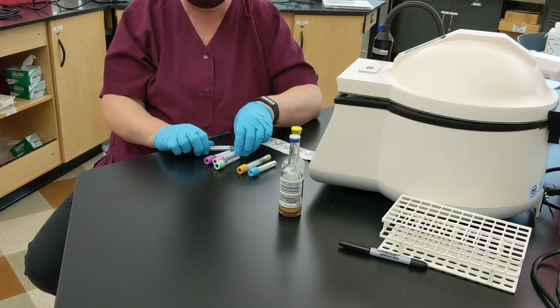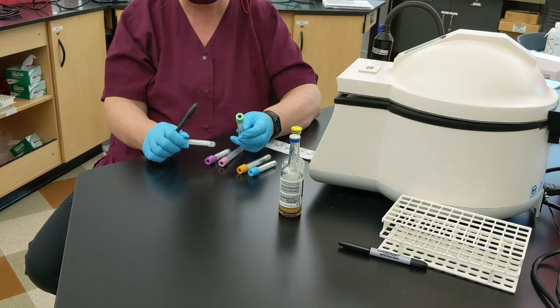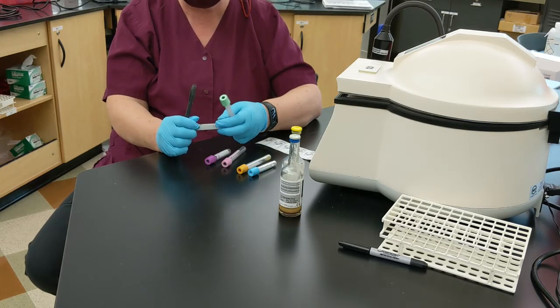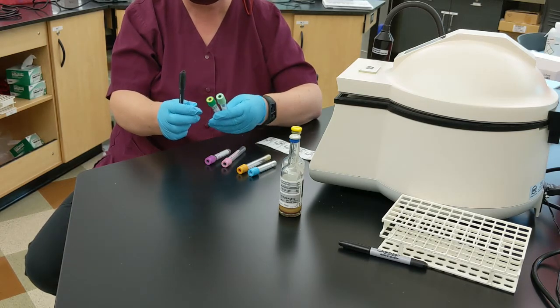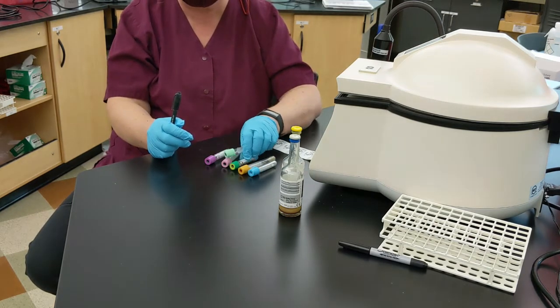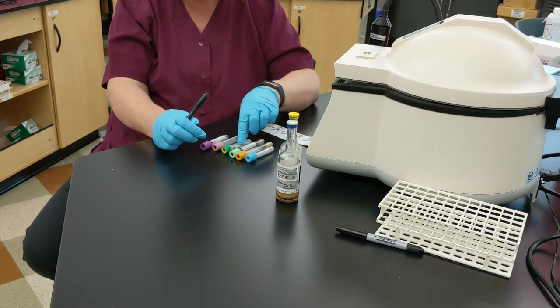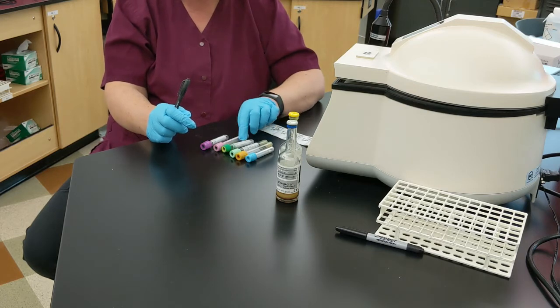Then the next thing you're going to do is go with your green tops, and that's heparin — lithium heparin. They also have gel at the bottom, so they would go next. It doesn't matter if you had the light green before the dark green; they're exactly the same, just different volume draws.